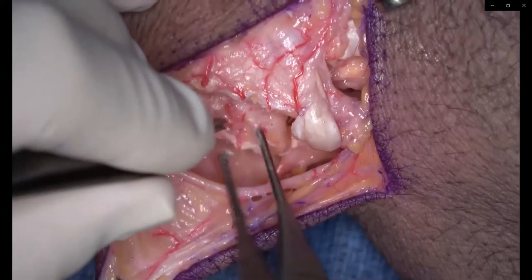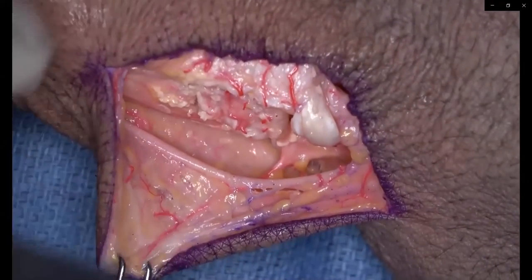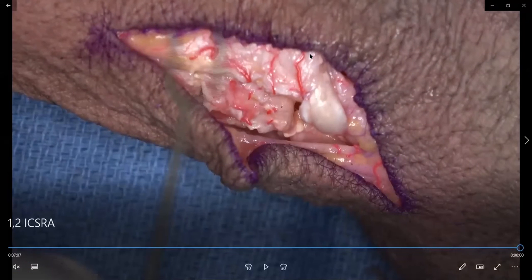In order to transfer this flap, carefully elevate the second and third compartment tendons, create a tunnel, and pass the graft beneath as shown. You also have to protect the dorsal radial sensory nerve branches, which tend to cross this incision — carefully elevate and retract them so you're not sandwiching them under the pedicle. Once done, orient your graft either horizontally or vertically depending on your fracture, which we'll see in the upcoming slides.